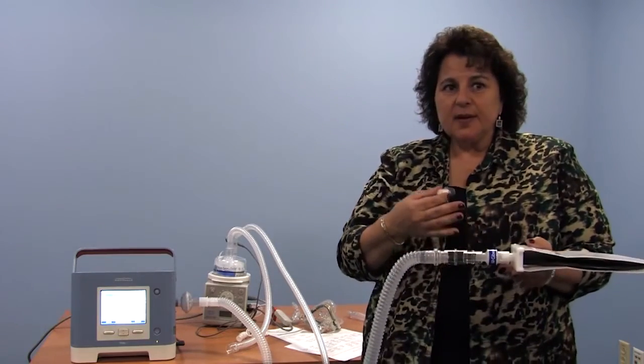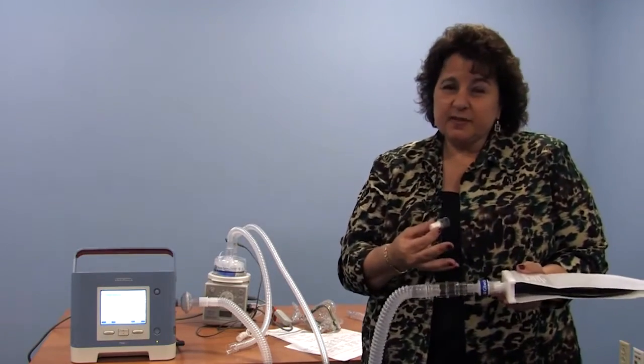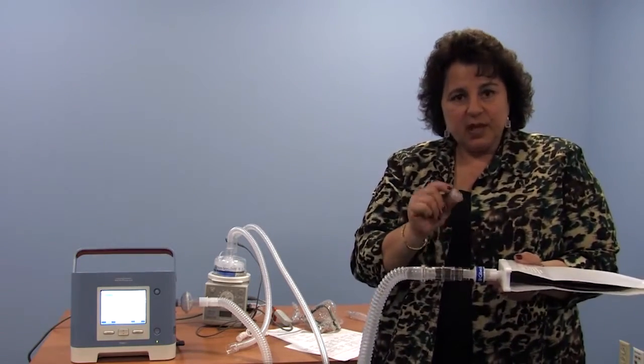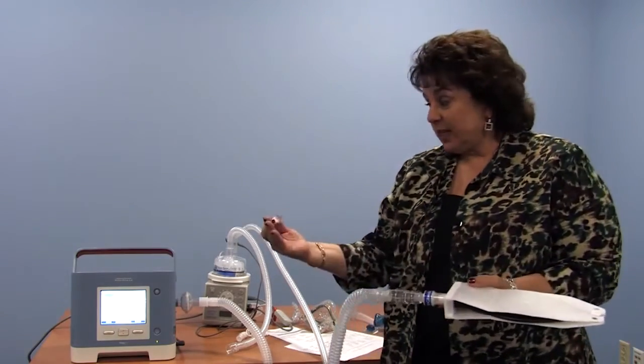The reason I tell folks about this and stress it is because things will be shipped to your home and they may ship you the wrong products, and they may look good to you because they give you more space and flexibility, but they may not be safe for your child. So talk with your therapist and your physicians about what equipment comes to your home, and don't use something that looks unfamiliar until you get it approved for use. So the heat moisture exchanger gives freedom from the home to children with tracheostomy tubes on ventilators.